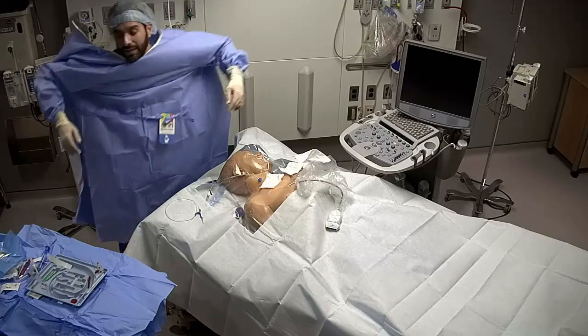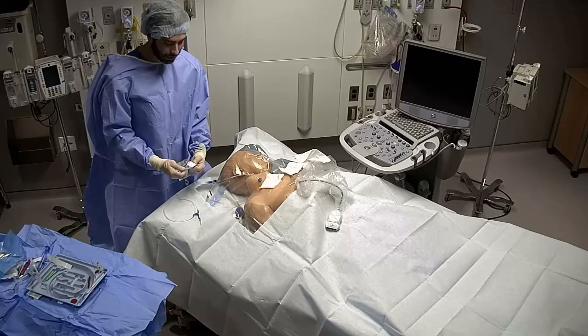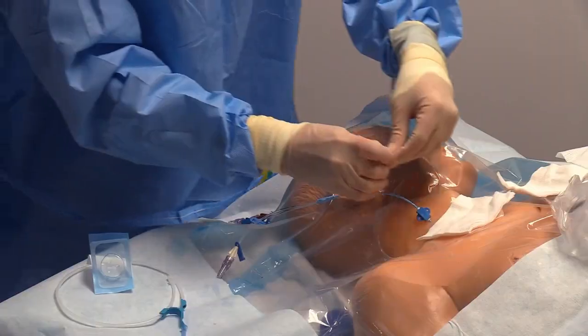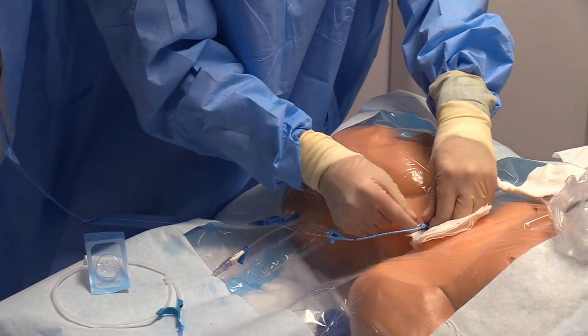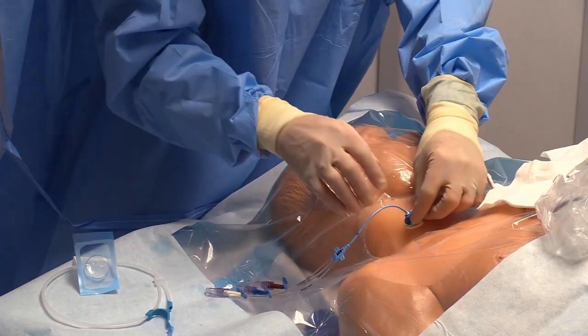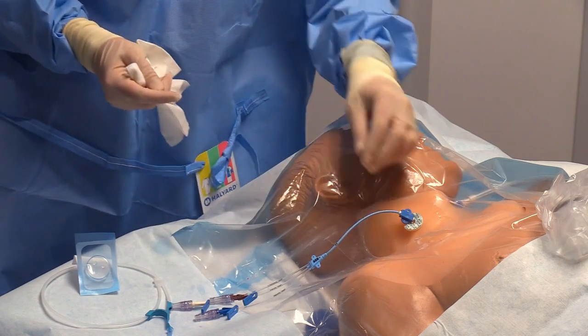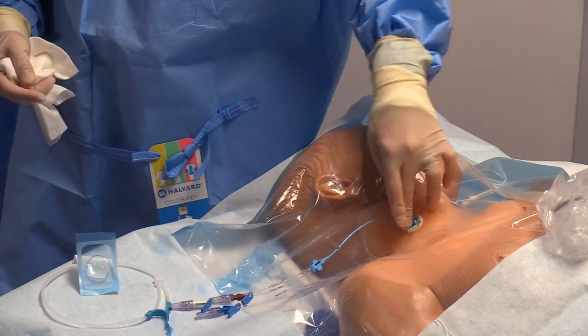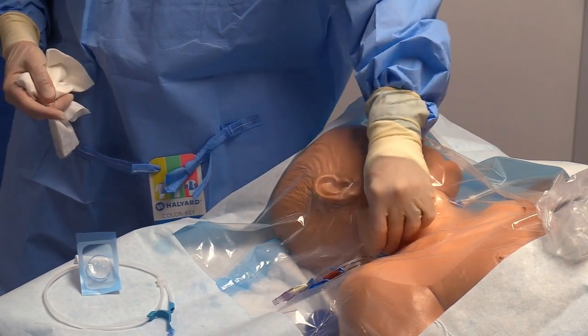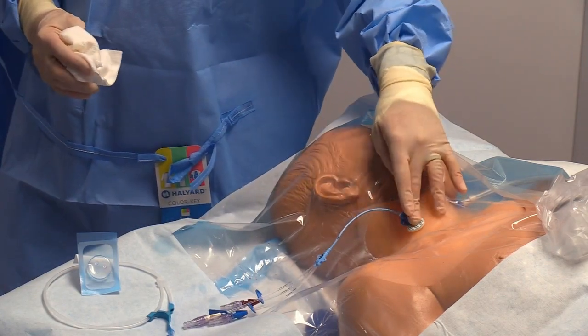Once the catheter is in place, what you're going to do is take your biopatch. Ideally, the biopatch is supposed to go underneath it, where the actual catheter goes in, so it's going to wrap around it this way. So now you have this here. So now you're nearly done. You've anchored it proximally. You've anchored it distally. Your catheters are in place. There's caps on top of them. The biopatch is in place.